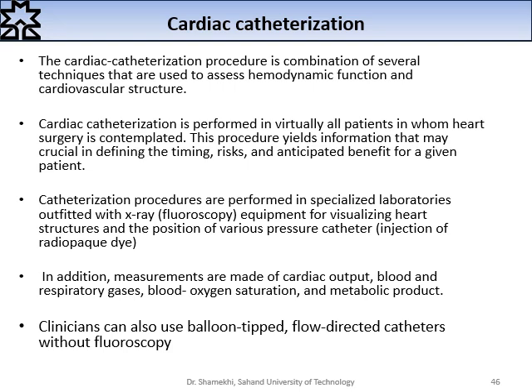Catheterization procedures are performed in specialized laboratories outfitted with X-ray or fluoroscopy equipment for visualizing heart structures and the position of various pressure catheters, and for injection of radiopaque dye.